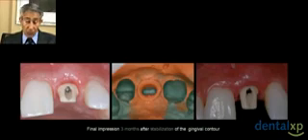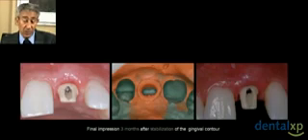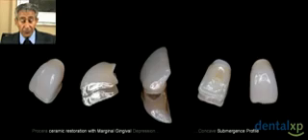So now we just have to wait for this tissue to mature. It could take 6 weeks, 3 months, 6 months. The time works with us. And when we find that definitely the tissue is thick enough, and that took 3 months after the second surgery, the exposition of the implant, then we took the final impression.